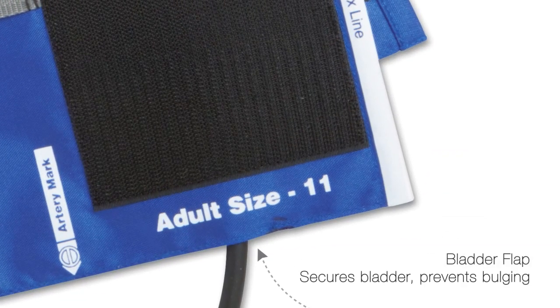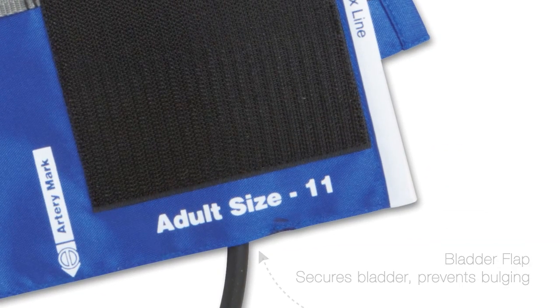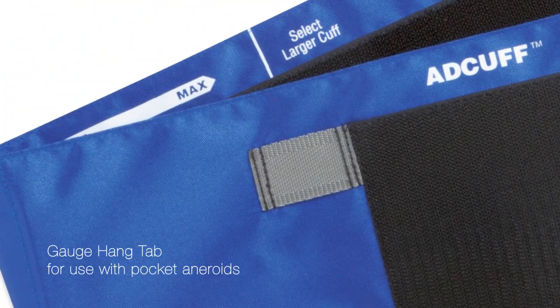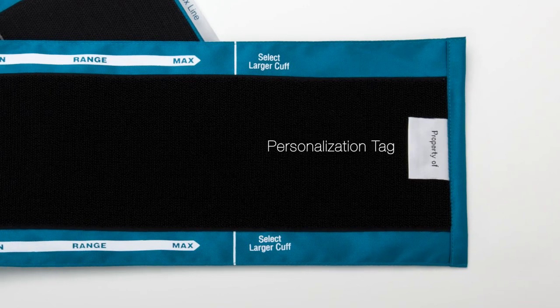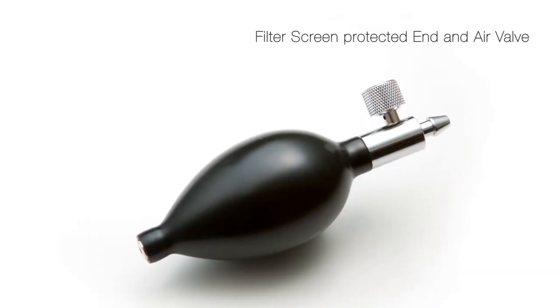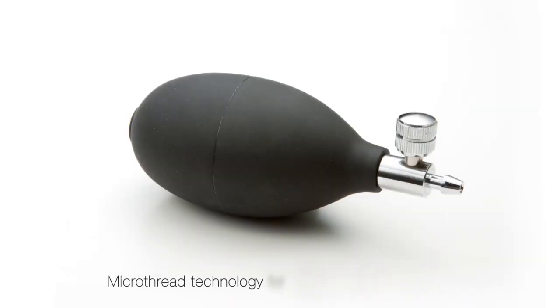Ad cuffs are among the most feature-rich on the market. The ad flow bulb and valve assembly is designed for precise deflation control and long life.